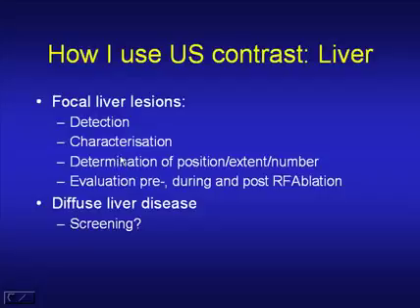One of the important things in planning surgery or radiofrequency ablation is to determine the exact number, position and extent of the liver tumors so we can plan our therapeutic procedures. And also we can use contrast agents to evaluate before we do ablation procedures, to monitor the ablation procedure itself and to follow up the result of ablation. And this is quite routine in my practice in my hospital, where we're doing 7 or 8 radiofrequency ablations each week.